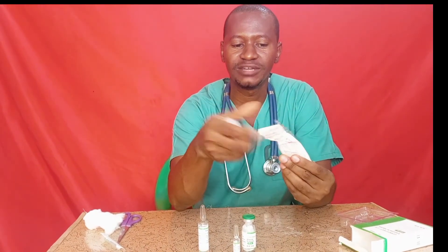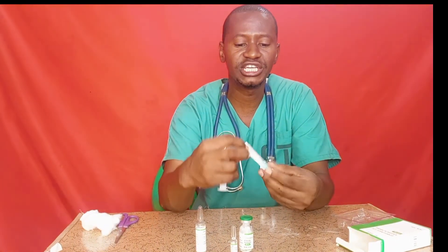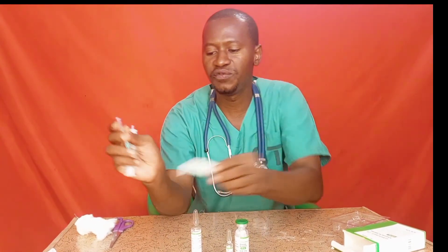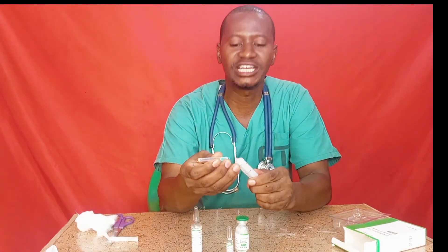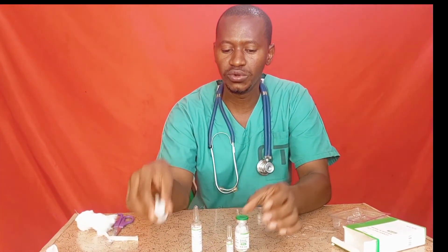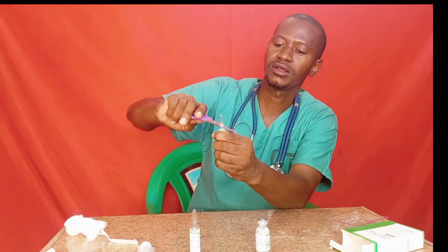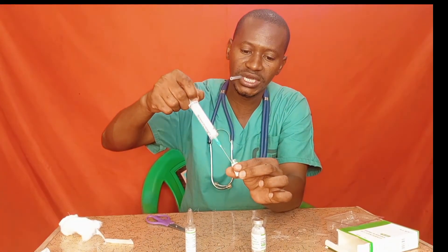Now let us do the procedure. First, get the syringe and open it gently. Then get a 21-gauge needle, remove it from the packaging, and attach it to the syringe. Next, open the vial of the drug, then withdraw the 2 ml of sodium bicarbonate.